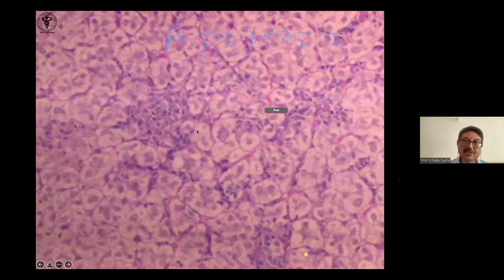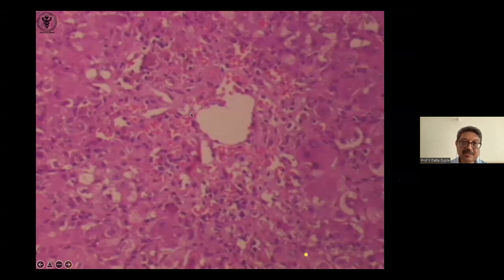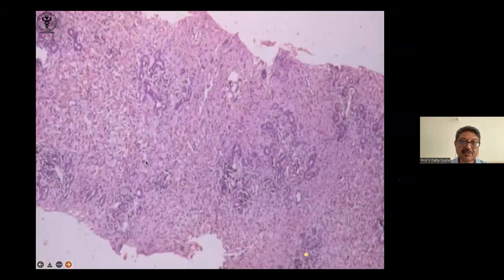Okay. Now this is an area of confluent necrosis. 1, 2, 3. You should have seen 2 or 3 hepatocytes here. On the other hand, you are finding a group of hepatocytes that are missing and there are inflammatory cells here. This is confluent necrosis, which is not qualified. This is another area of confluent necrosis in the centrizonal area around terminal hepatic venules. These hepatocytes are lost. So this is unqualified.